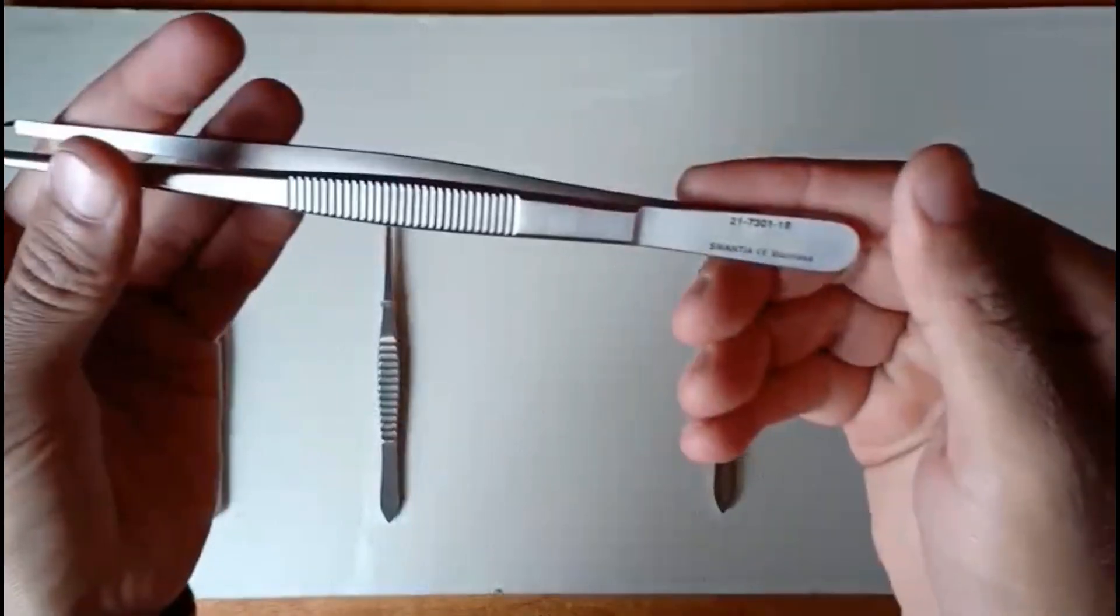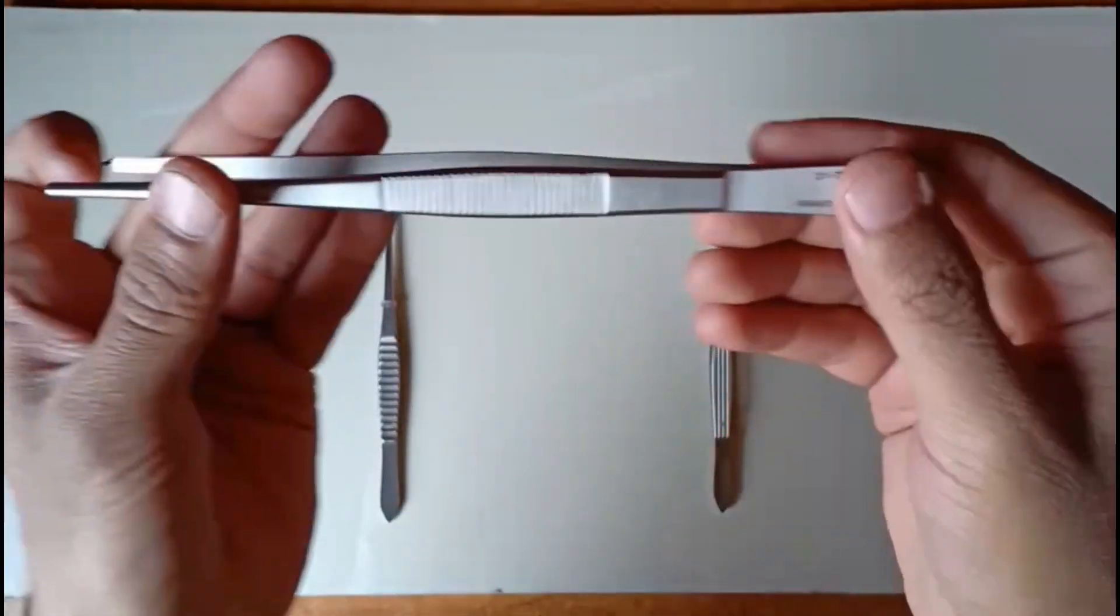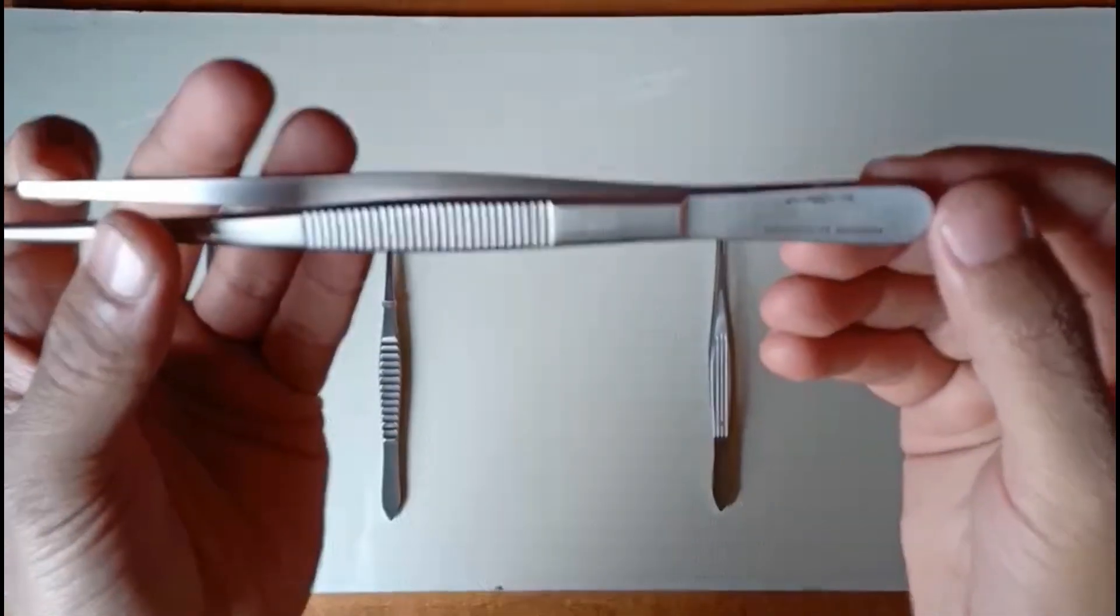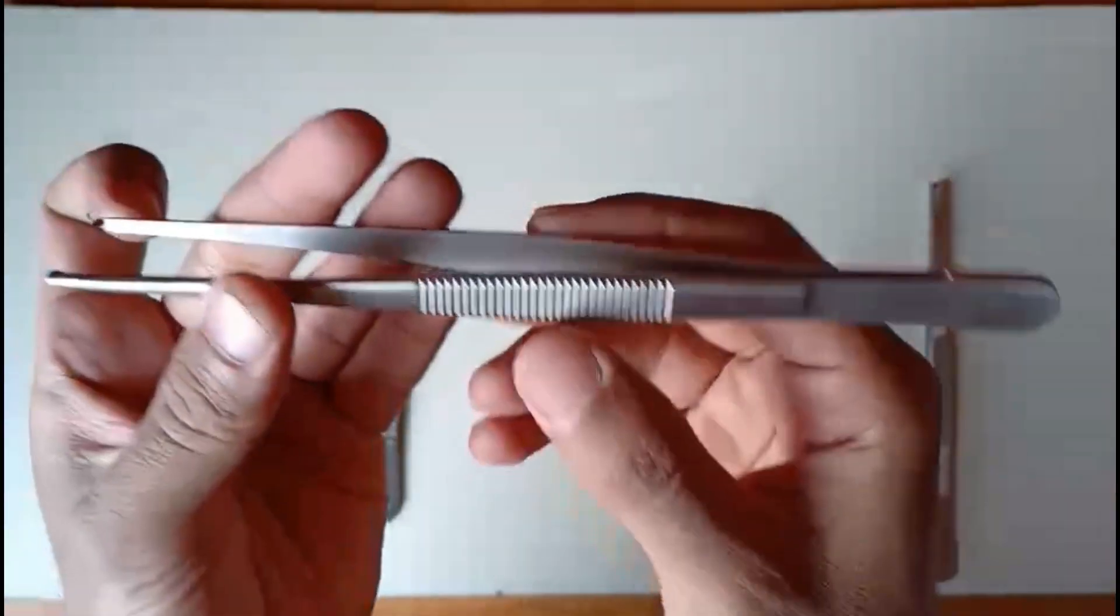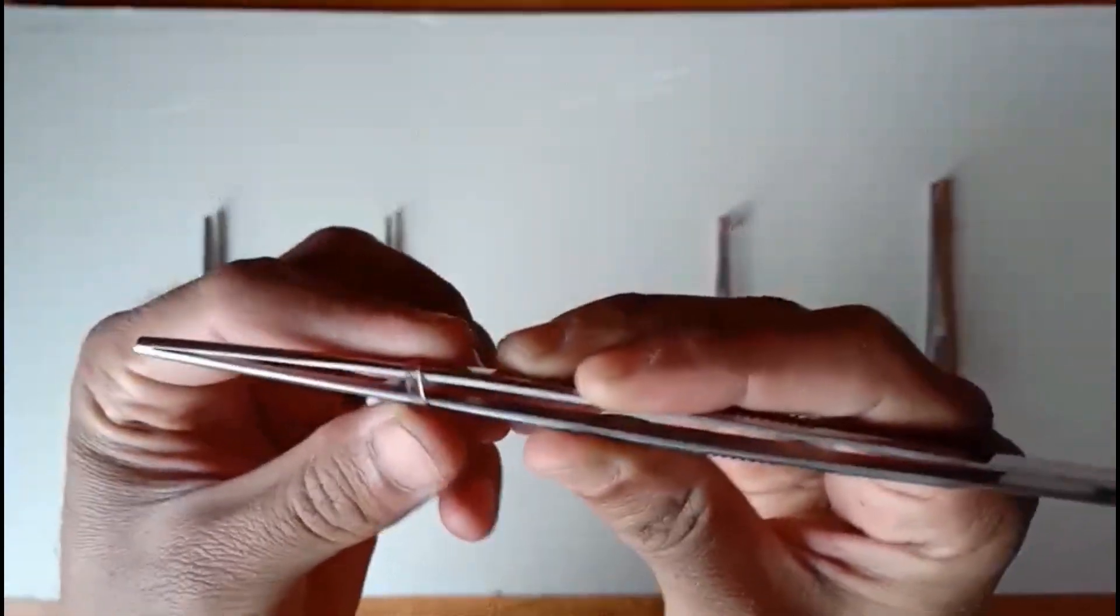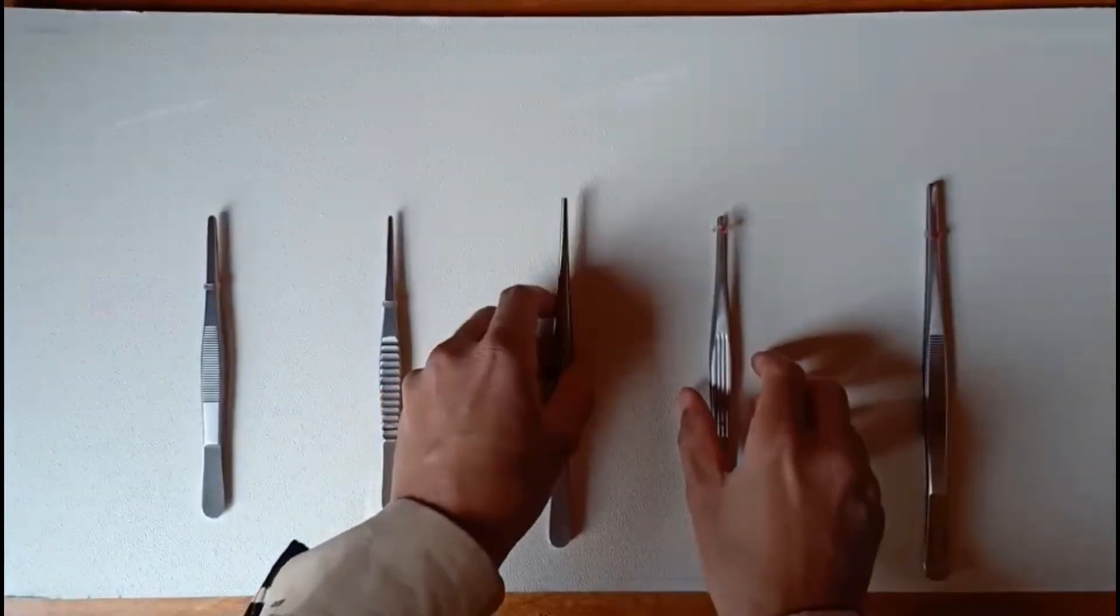This jaw-type forceps has catalog number 217301-18. Other sizes are also available on the website.